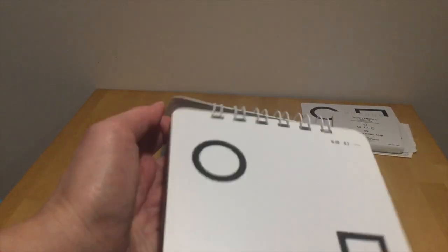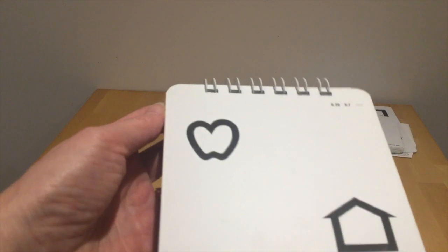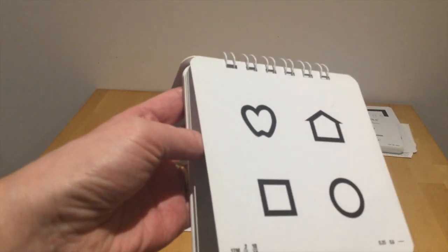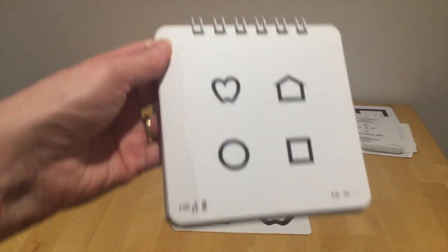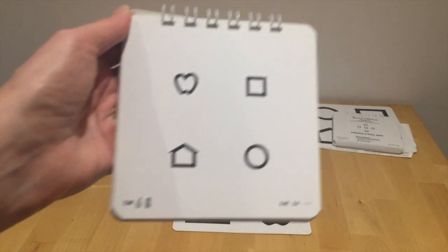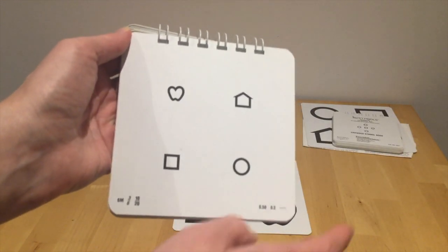And now we're down to 3/15. And we turn it over. Still 3/15. Then 3/12, slightly more crowded, but not completely. 3 over 9.5. 3 over 7.5. 3 over 6.